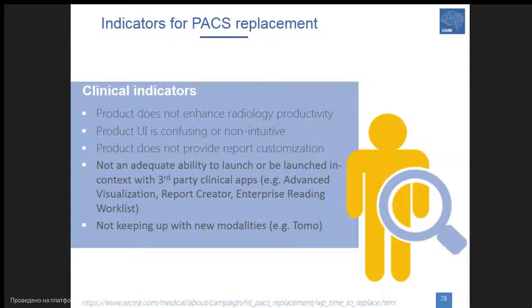Back to indicators. There are also clinical indicators. If the current PACS does not enhance radiology productivity, if the user interface is confusing, if it doesn't provide report customization, if it does not allow launching third-party clinical applications, and if it's not keeping up with the new modalities, then again you have a problem with the PACS.